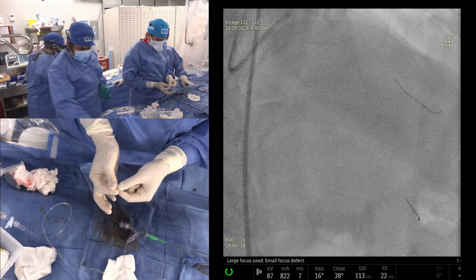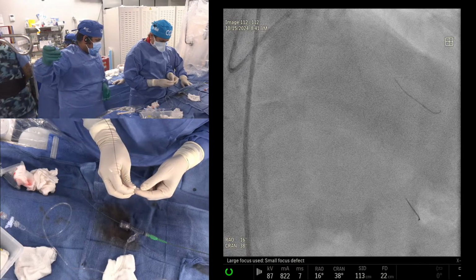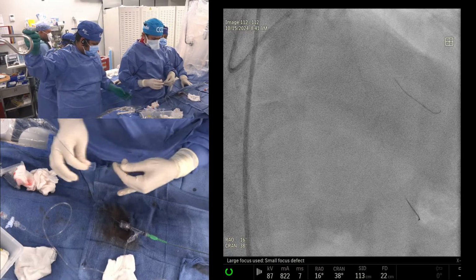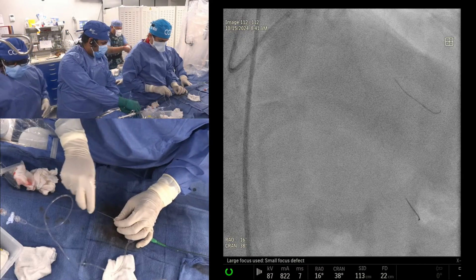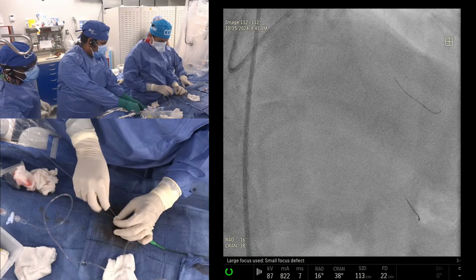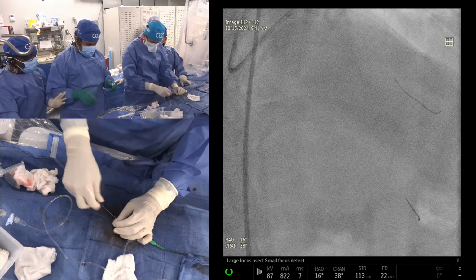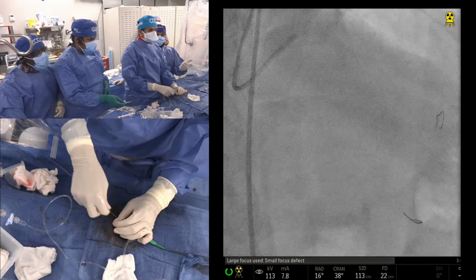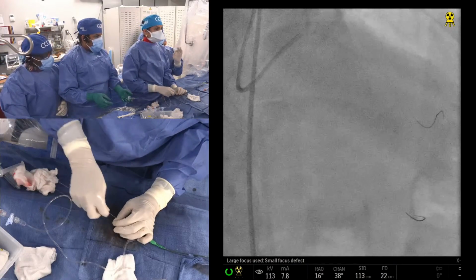So, Samin, another question has come. I'll quote it exactly as it is: why the rush to remove the right contralateral catheter? Okay, so the question is about the utility of the catheter now. Your wire is very nice, you have good antegrade injection. So if we leave the catheter, what will happen? There is always a chance you make thrombus, some little clot on the tip.